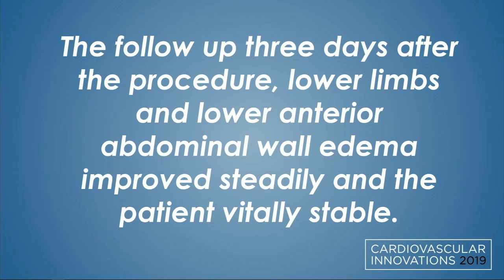We can use another option, which is CT angiography. But unfortunately, it gives us a higher estimate of the actual IVC diameter. Yeah, and with the compression, it's not going to help because there's external compression. Any thoughts from the panel? Questions? I've been involved in cases using both single stent as well as double barrel. Does anybody else have a preference, or is it just a matter of what sizes are available, or any different approach?